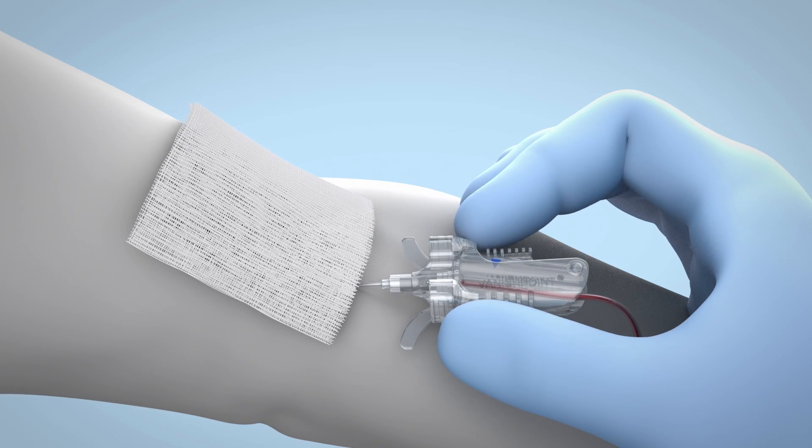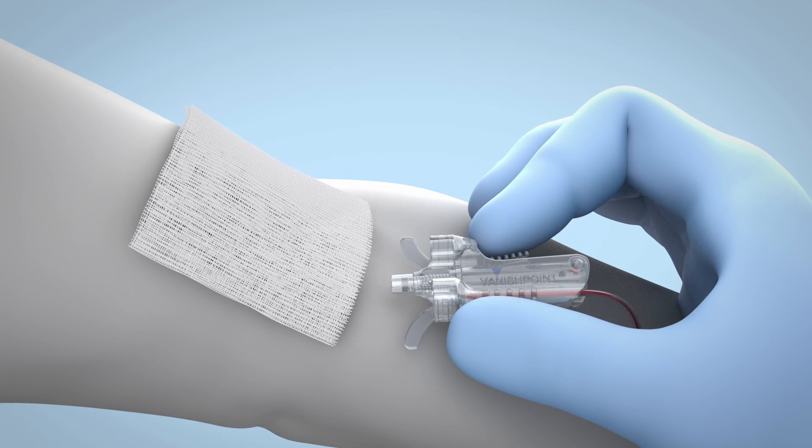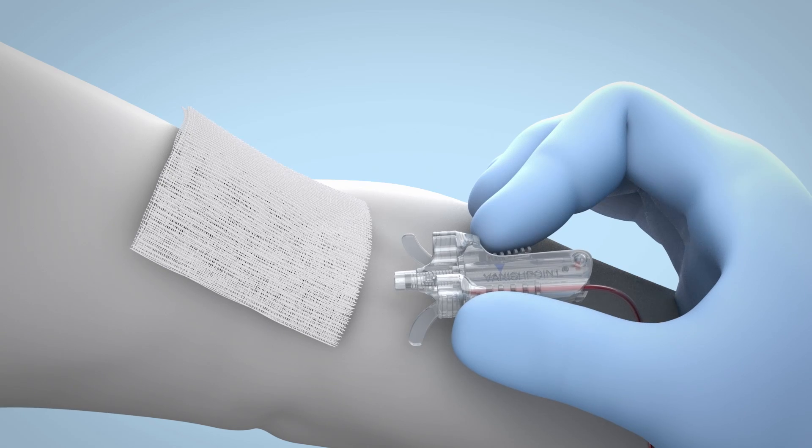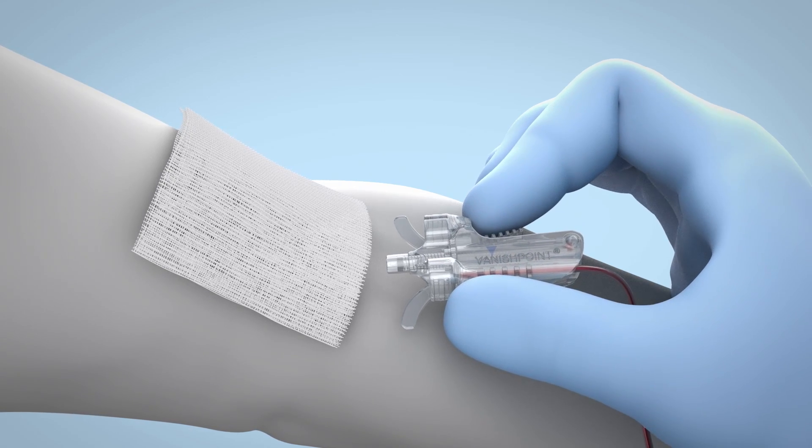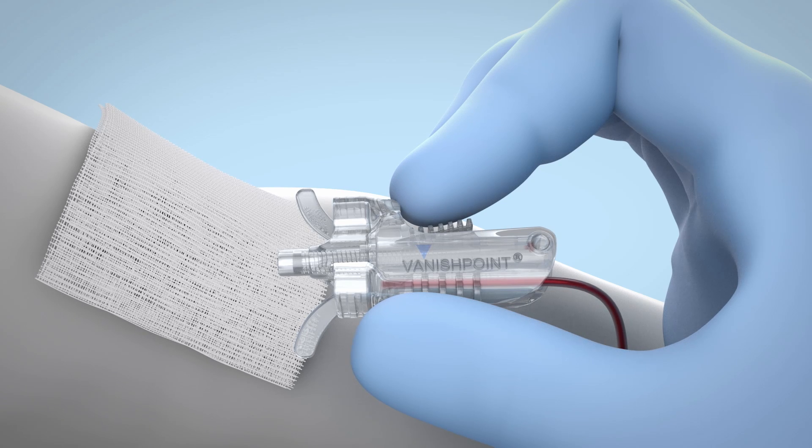Simply press the trigger and the needle is automatically retracted directly from the patient, virtually eliminating exposure to the contaminated needle. As the needle retracts, the tubing is automatically clamped, reducing the risk of exposure to blood.